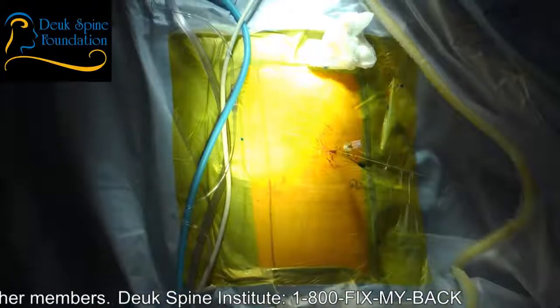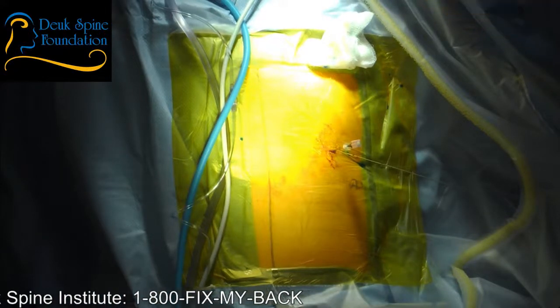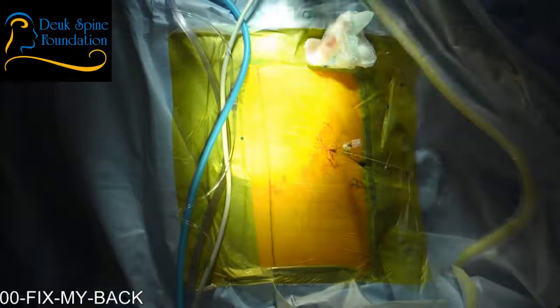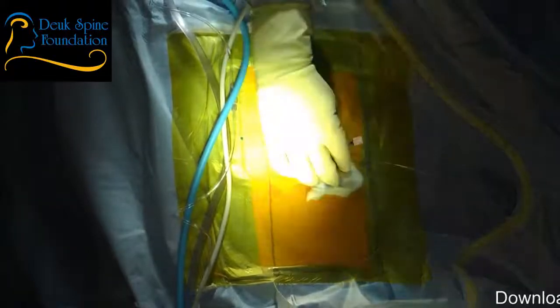Now, the reason why I had to apply more force to get the needle in the disc is because her discs are completely collapsed, so they're actually resisting the needle going in. Plus there are bone spurs that are pushing against the needle, trying to keep it from coming in. Basically, the disease is fighting me and doesn't want me to gain access to the disc to repair it.